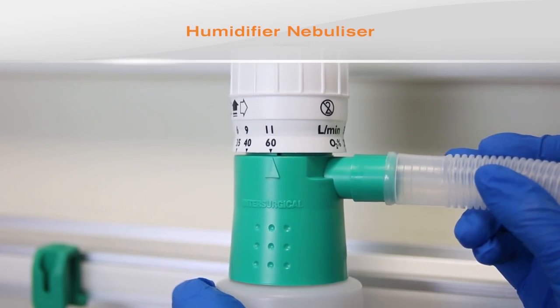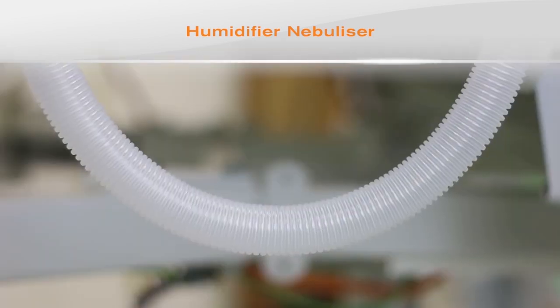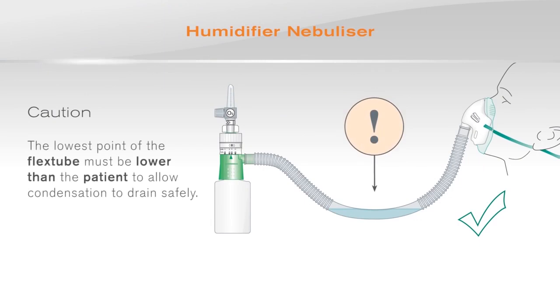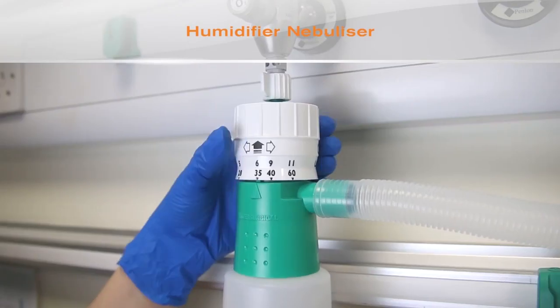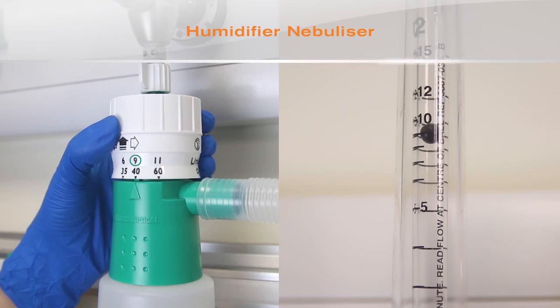Attach 22mm flex tube to the outlet of the humidifier nebulizer. It is important to position the tubing so that the lowest point is below the patient and to regularly drain any condensate to prevent any condensed water from running into the patient or occluding the flex tube. Attach the aerosol mask and then adjust the oxygen concentration to the required level. Set the flow meter to provide the required total flow to the patient.